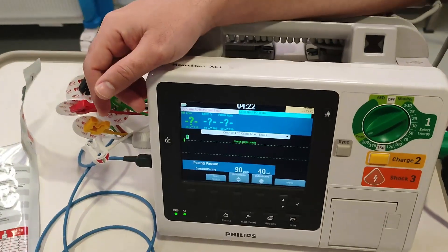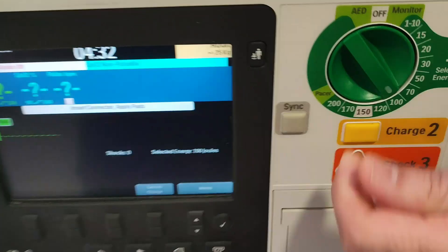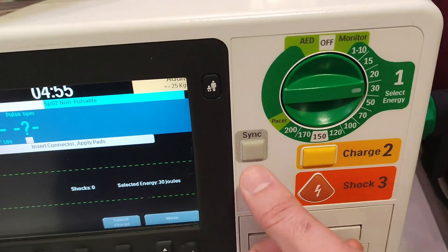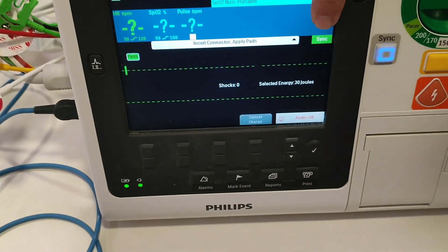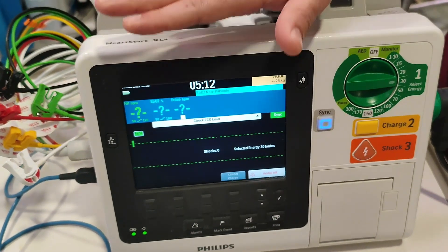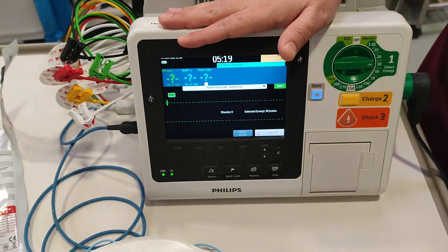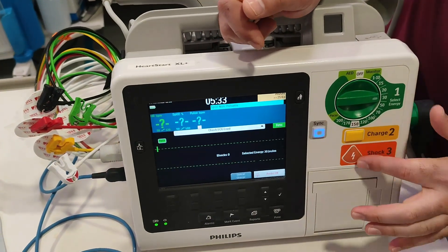For delivering synchronized shock, the shock will be delivered on the peak of the R-wave. Switch from pacing mode back to the joule mode — it will deliver the shock on the peak of the R-wave. Press this sync button and the defibrillator will show you it is now synchronized. In this mode, you don't need to do anything manually because the defibrillator will automatically detect the peak of the R-wave and deliver the shock.